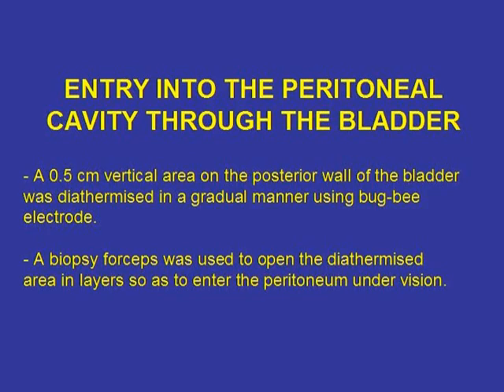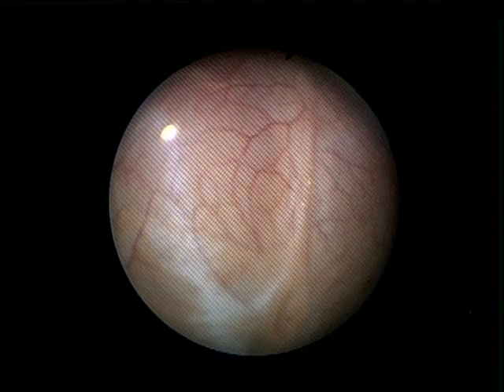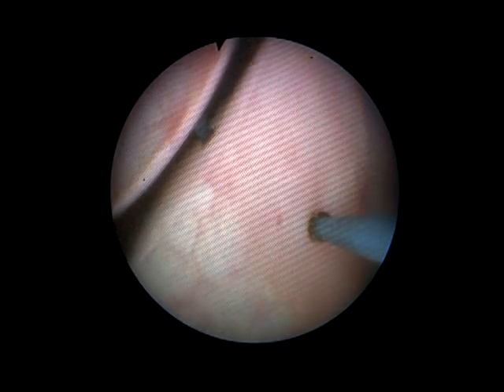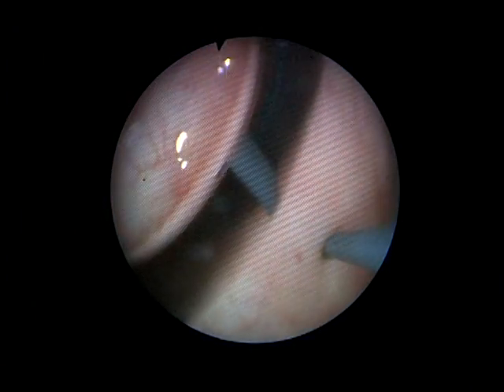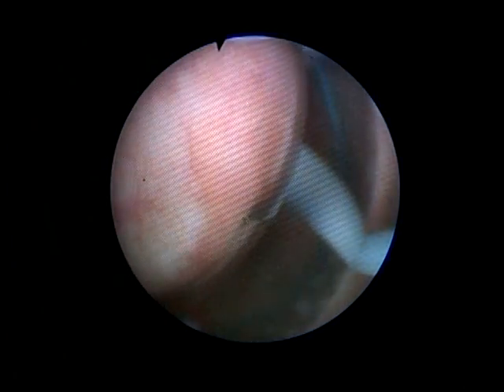Before the start of the bladder incision, the bladder was emptied and 100 cc's of glycine solution was instilled. The air bubble was used as a landmark as the bubble extended from the dome to the posterior bladder wall.